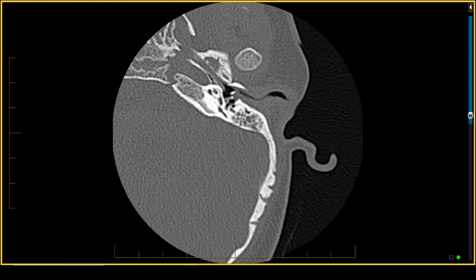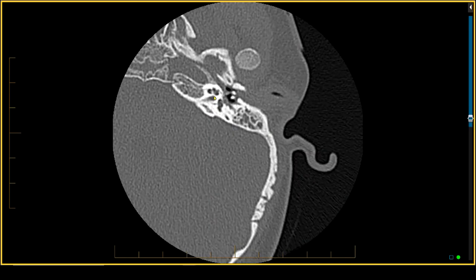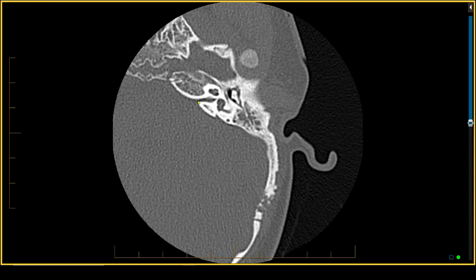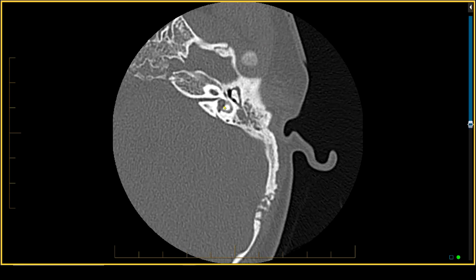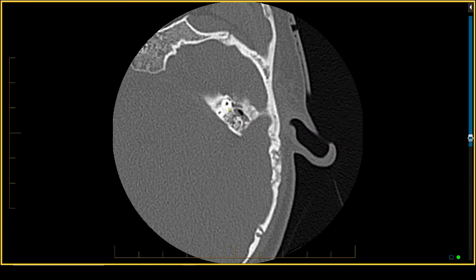Looking at the contralateral side, it too has this low density around the cochlea, again identifying the otospongiosis. Once again we have cochlear aperture stenosis and a narrowed internal auditory canal. This patient with Down syndrome has a normal bone island and a normal appearing vestibule and lateral semicircular canal.